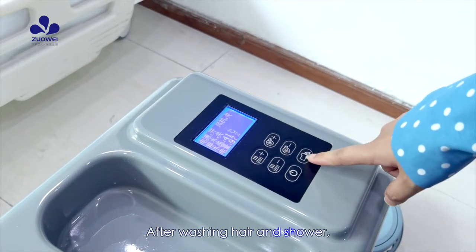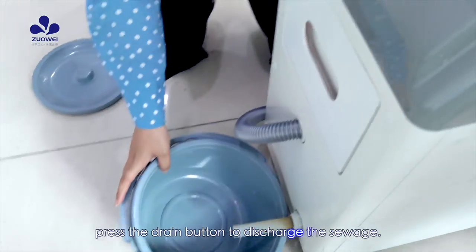After washing hair and showering, press the drain button to discharge the sewage.